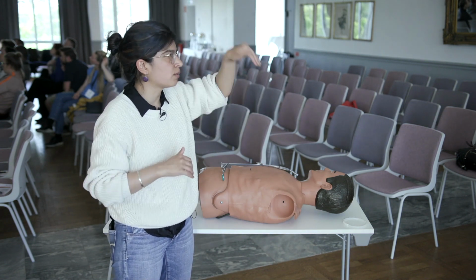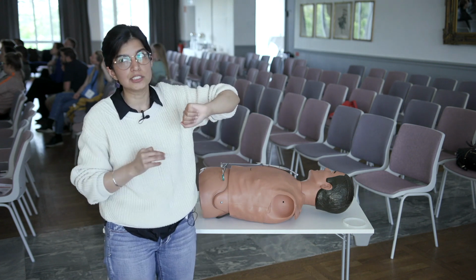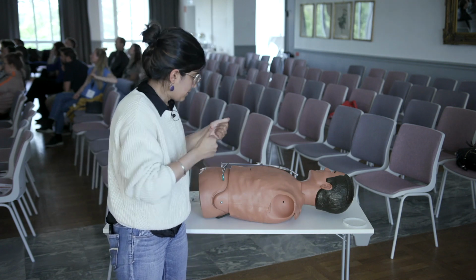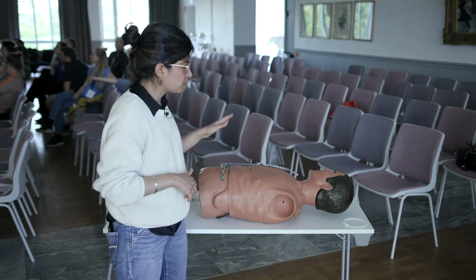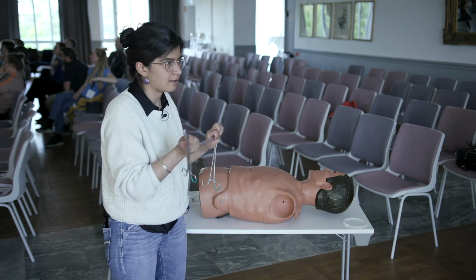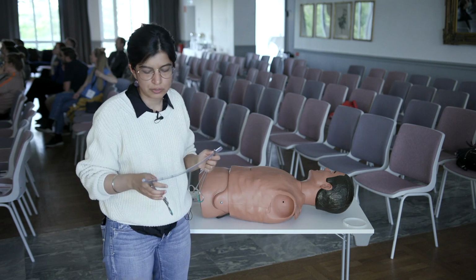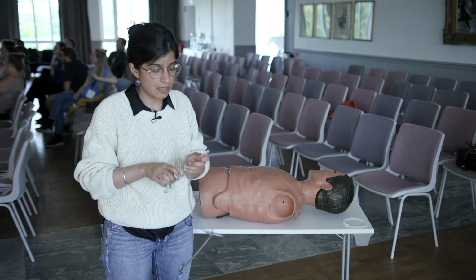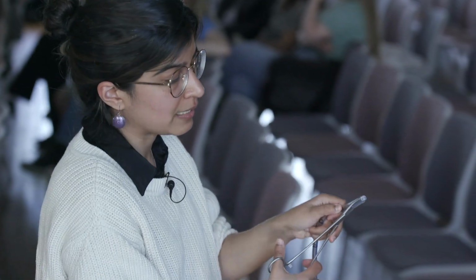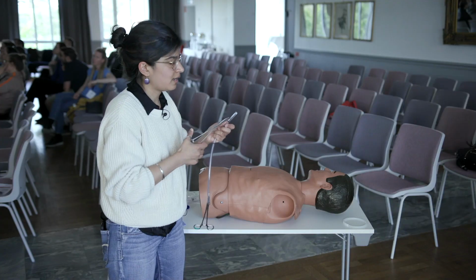So why do we go above the rib? Because the neurovascular bundle runs below the ribs, right? Excellent. Okay, so you've numbed up your patient, and while the lidocaine is taking effect, that's when I set up my drains. This is the standard approach. One of your colleagues was telling me, we don't have this little hard plastic bit up here that you guys apparently have. So she said, what I do is I just clamp at the very tip, but apparently these things can break, so don't do that.